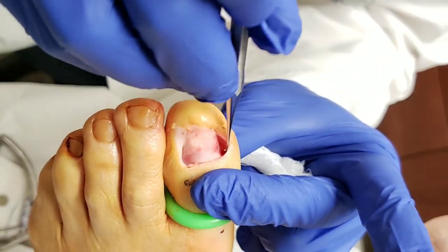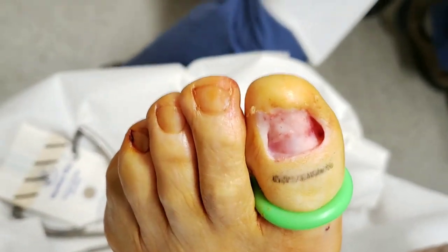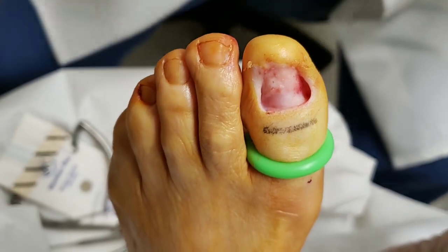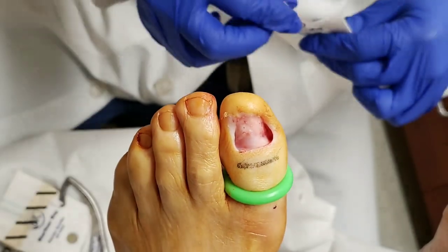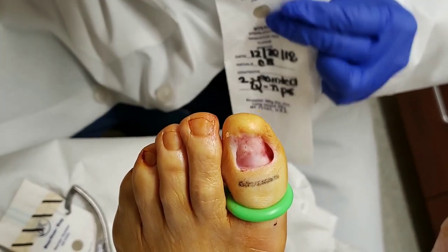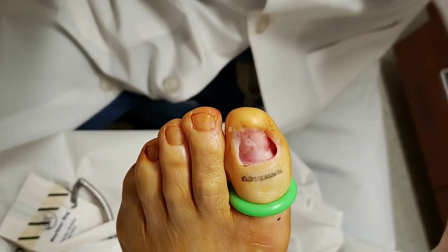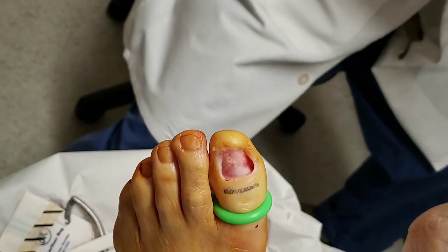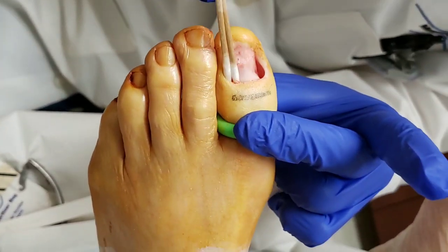So what I like to do is just kind of rough up this area underneath here, make sure I got all the nail off — and it looks like it's all off. It's not bleeding because I put the tourniquet on there. Now we take some sterile Q-tips, and I turn the timer on for about 30 seconds.